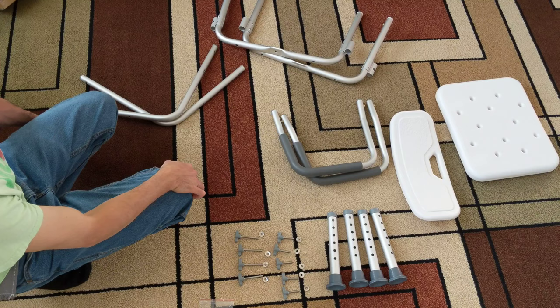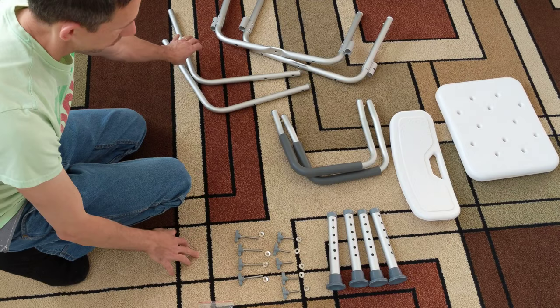Hey friends, today I'm going to assemble the Vaughan medical bath chair. Alright, so we'll just see what we have.